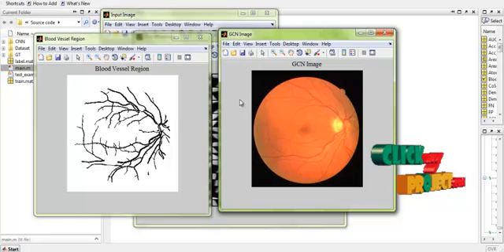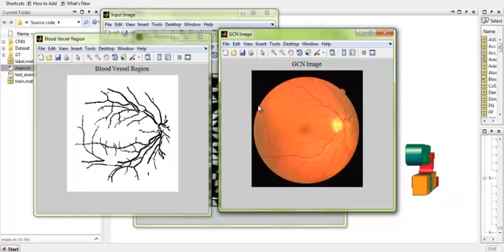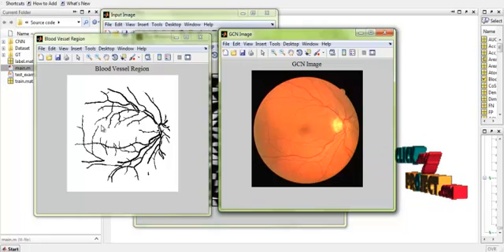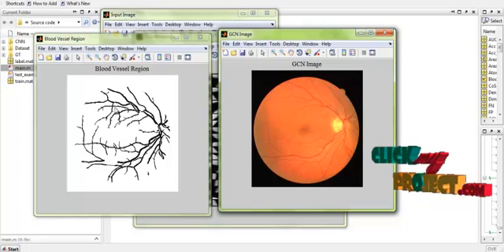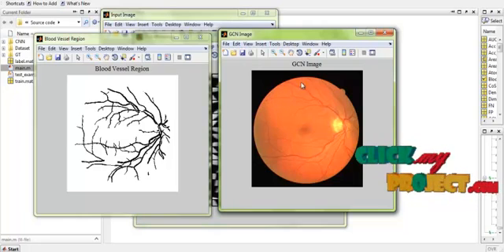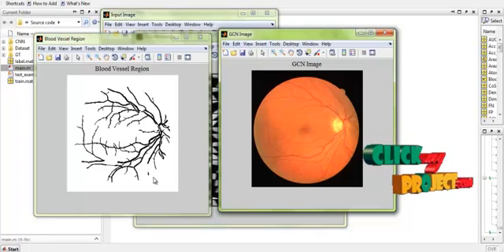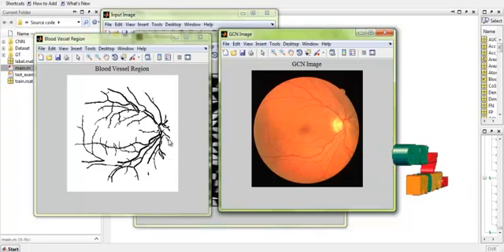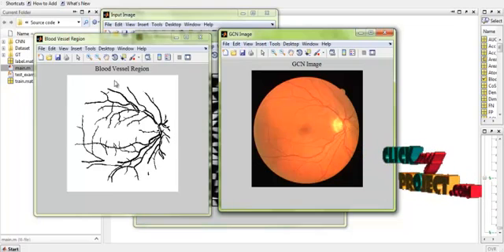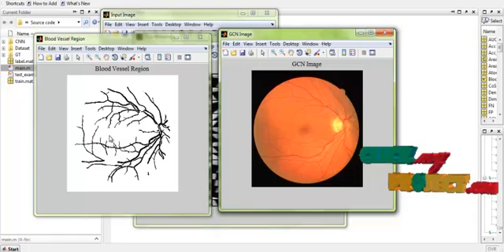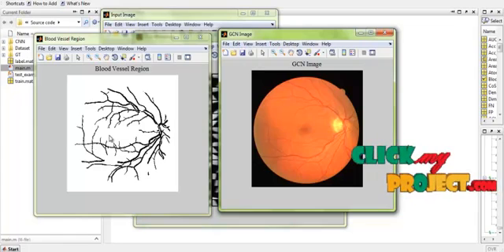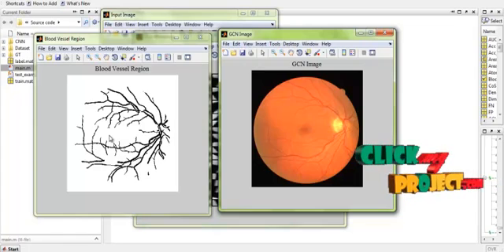As we can see, the blood vessel regions alone are segmented from the input image and they are represented in black color. The other portions are represented in white color.